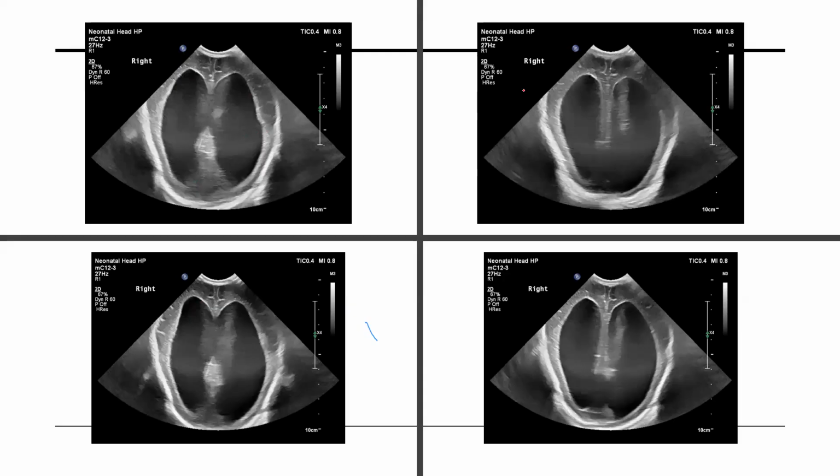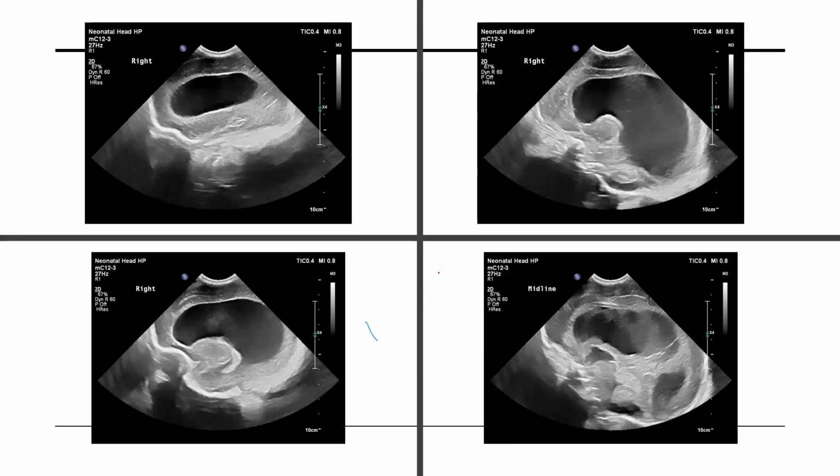And when you look at the occipital part of the brain, very bright ventricles again, but it's really obvious when you look at the lateral sections. Can you see how bright the margins look? They're actually as bright as choroid. That's what you're really looking at, especially in this region over here. So basically, this baby has developed post-infectious ventricular dilatation, not post-hemorrhagic ventricular dilatation. After the initial IVH, which was just grade 2, the baby didn't have ventricular dilatation, but after 3 weeks of antibiotics, we developed it.